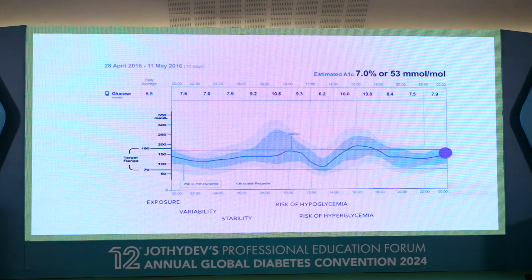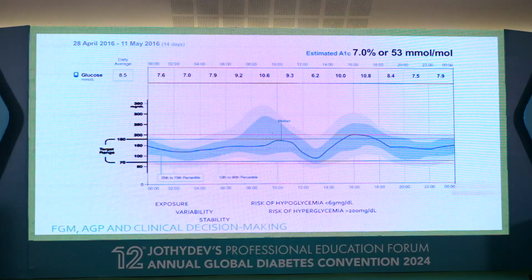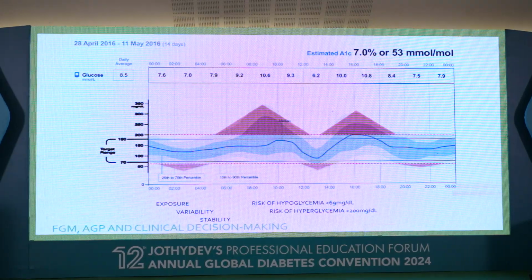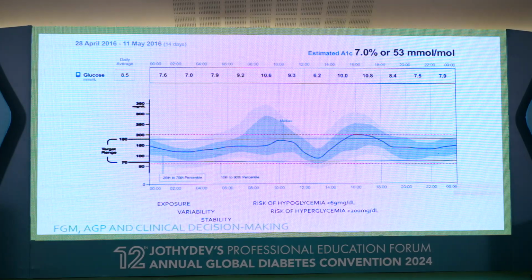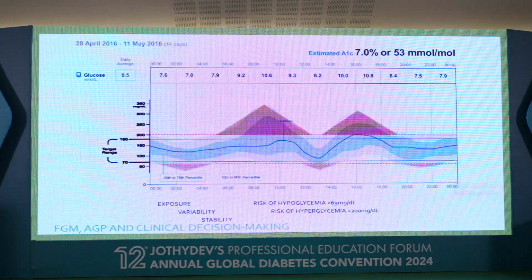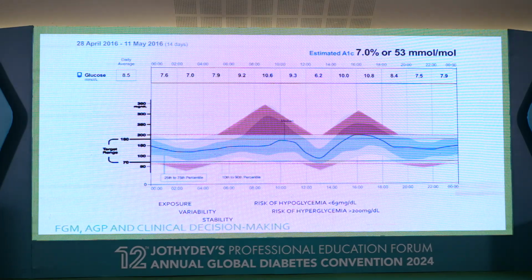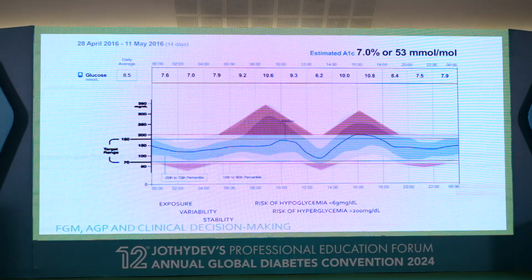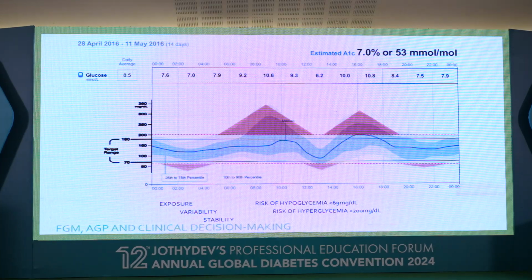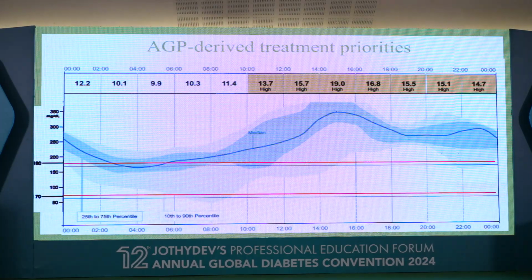So this is the movement of sugars that you're trying to track through the median. So what is it that you want to see? Now when you have sugars in this format, you want to see how much is the exposure. So going above the range, all the pyramids that you see are the sugars rising above the 180, 200 mark. This is all high, and then you're seeing some inverted pyramids going below the 70, which is hypoglycemia range also. So how do you really treat?